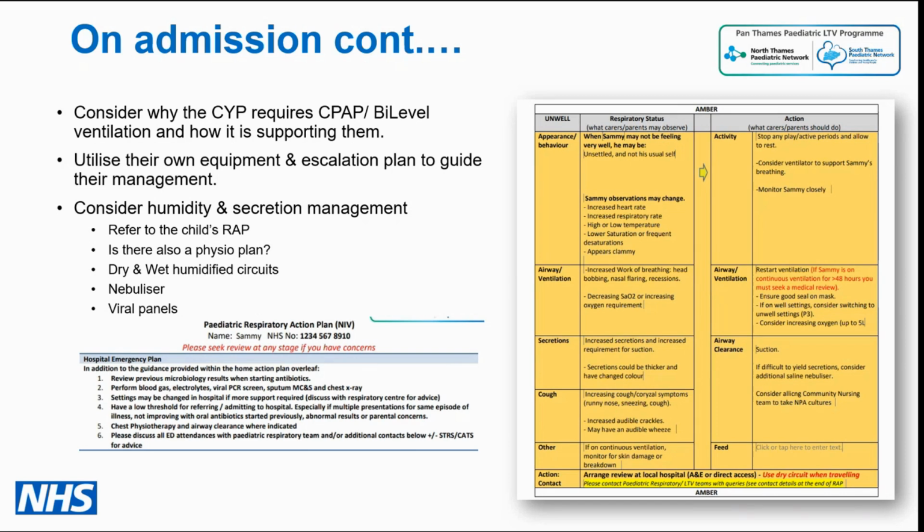Utilise the child's own equipment. Most or many of our children have unwell settings now also programmed into them. So if they meet that criteria, you can escalate up, and it doesn't require unlocking the ventilator and changing settings. They're already pre-programmed, ready to go in that safe environment.